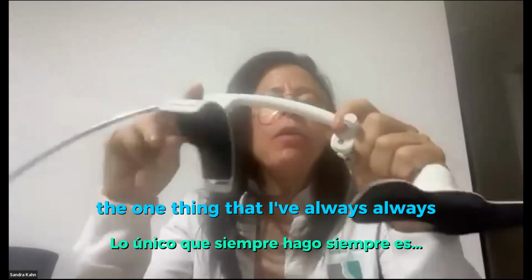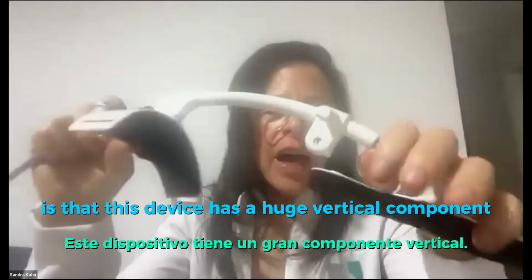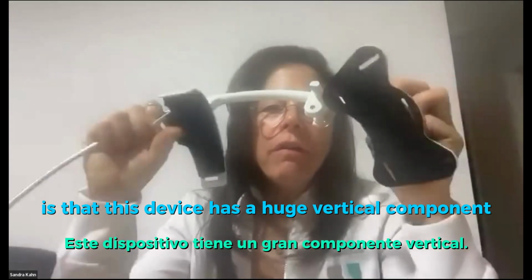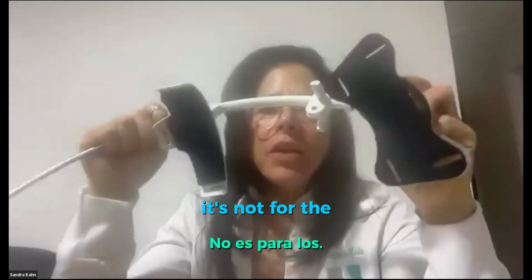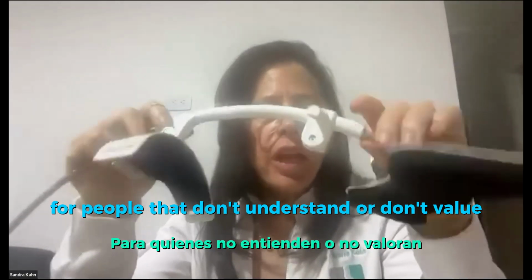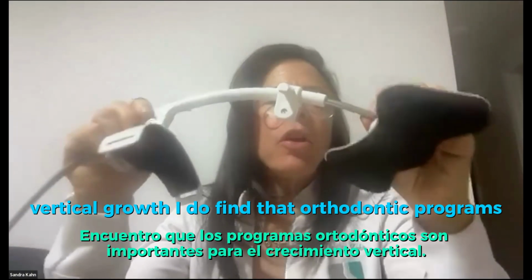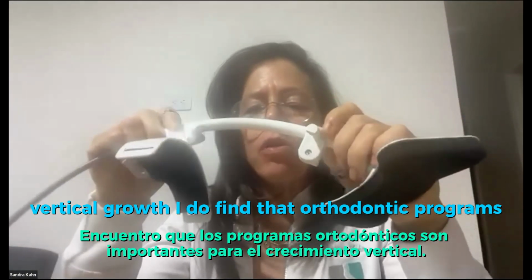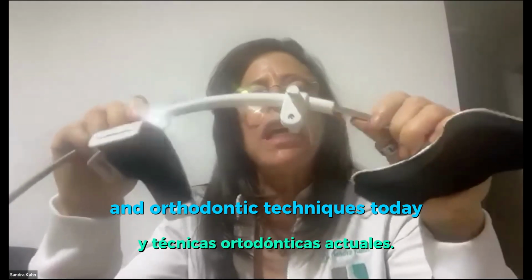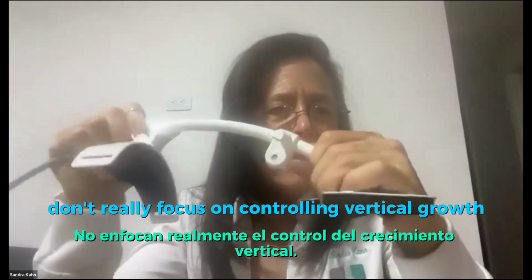The one thing that I've always underlined is that this device has a huge vertical component. It's not for people that don't understand or don't value vertical growth. I do find that orthodontic programs and orthodontic techniques today don't really focus on controlling vertical growth.